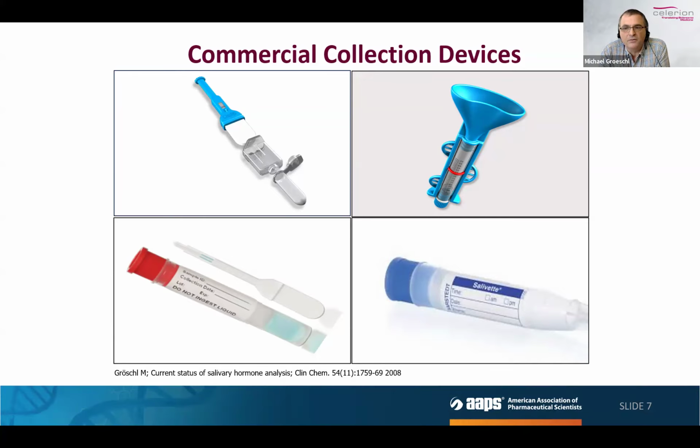I published several papers on this topic at the time, which demonstrated the complete inadequacy of saliva collected on cellulose or cotton rolls for the analysis of cortisol and insulin. As a result, substitute products such as the widely used polyester-based Salivette, shown on bottom right, came on the market. With this material, almost 100% of analyte recovery could be demonstrated. The use of systems with integrated stabilizer solutions, as exemplarily shown in the bottom left, is recommended for later PCR analysis.